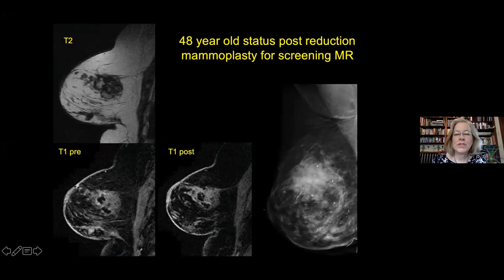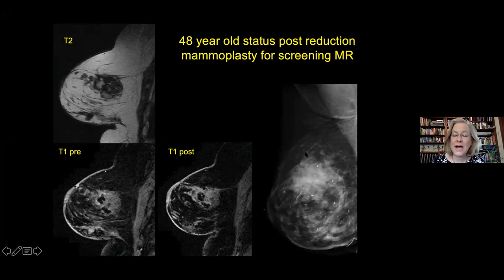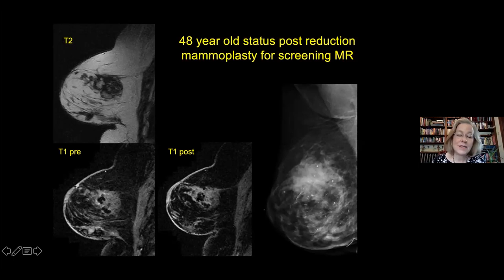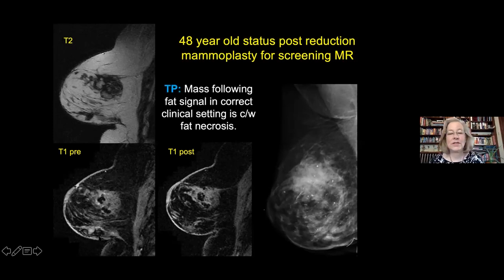Case: a 48-year-old who had a reduction mammoplasty, presenting for screening MR. Her mammogram shows classic reduction changes—a swirling pattern, more confluent tissue superiorly, and coarse benign calcifications. On MRI, T2, T1 pre- and post-contrast images show a more focal area of enhancement corresponding to that focal island of tissue on mammogram. Within it, there are non-enhancing areas comprised of fat—following fat signal on T2 weighted and saturating out on pre-contrast. This is just fat necrosis, an expected finding in somebody who's had a reduction mammoplasty.